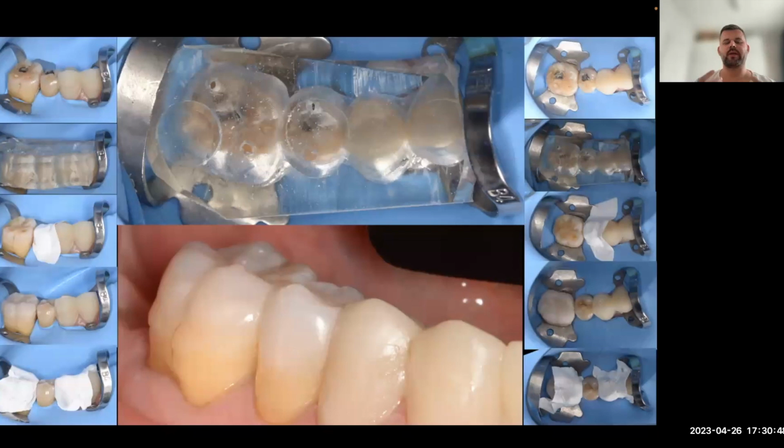And of course, you can also use this normal, traditional, flexible silicone index to restore the posterior part also. But I like to restore only the occlusal part of the teeth. I don't like to restore all teeth with composite, only the occlusal part, like the tabletops. Of course, when you have some caries on the occlusal surface or an old filling and you want to remove this, you can do that and restore this at the same time when you restore using the flowable composite.